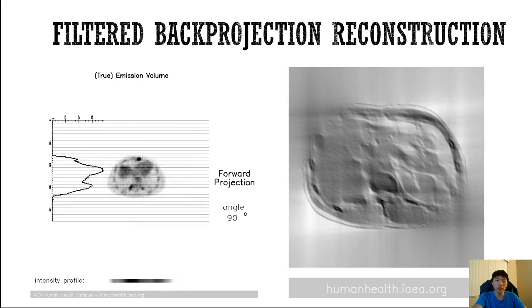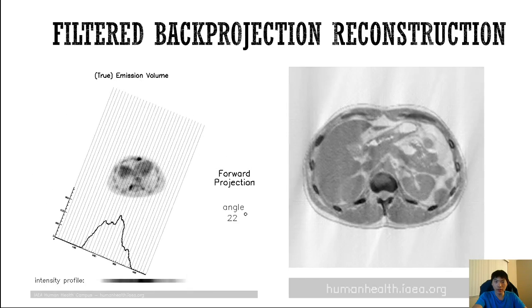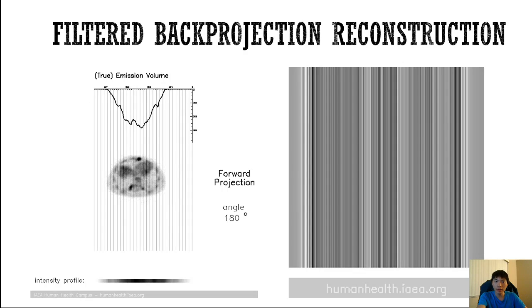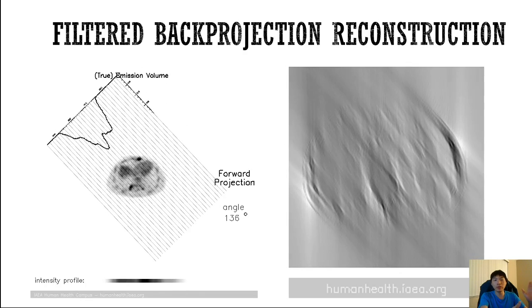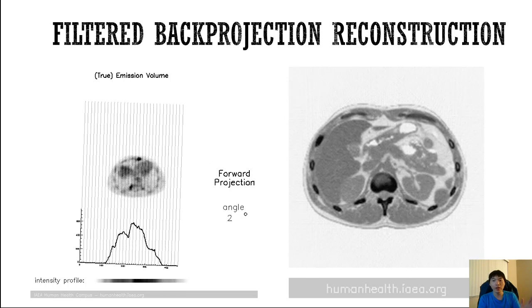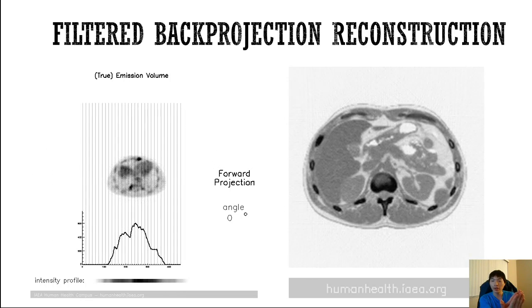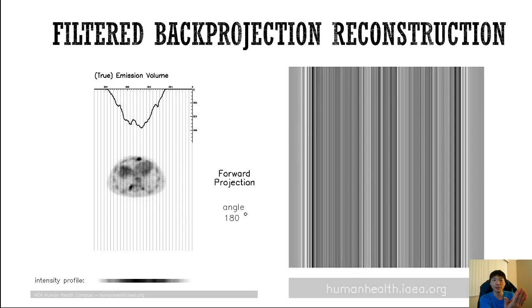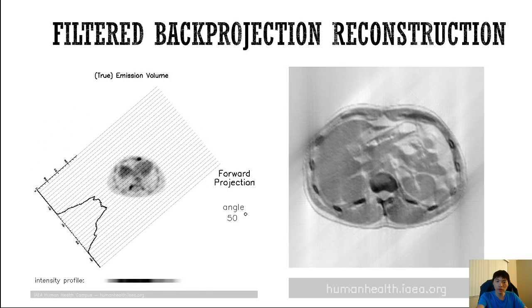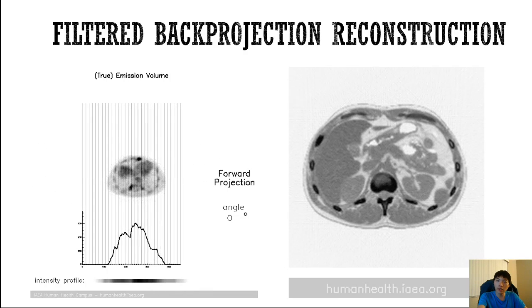And so this is kind of extending our idea of plain film X-rays. So you can imagine maybe you take a lot of plain film X-rays at different angles, and then you stack them all together, and that's how we get our back projection image. So here we can see the nice reconstruction, and we can see now the signals in 2 dimensions.